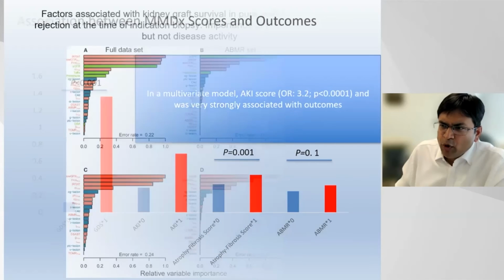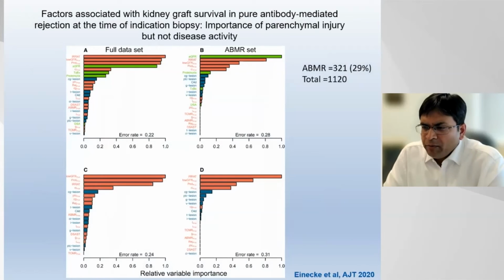And this has once again been reported already in the ABMR cohort by Dr. Halloran, and this data includes our own center data. What you can see on this slide is that the IRATs, which is injury repair associated transcripts or AKI transcripts, are by far and ahead the most important transcripts to predict outcomes in the ABMR patients. The point of this paper is that one needs to consider severe AKI in the algorithm of outcomes. And once again, the impact of this is with regards to management approaches as to how aggressive or how conservative one needs to be when managing a patient.